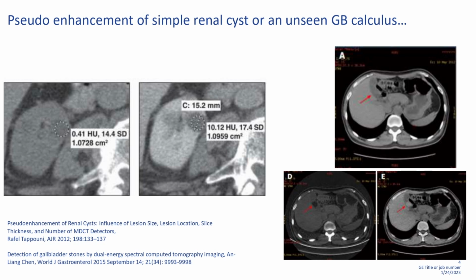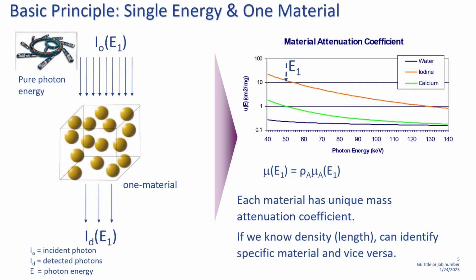How we do a dual energy acquisition. Okay, very simple. You know this equation always, the old famous equation, I is equal to I0 e raised to minus mu. Is monochromatic truly monochromatic, or is it calculated from two attenuation values? It is calculated from two references. We'll see that.